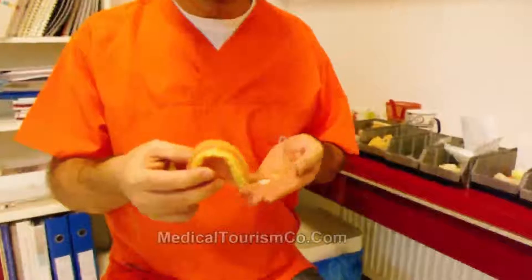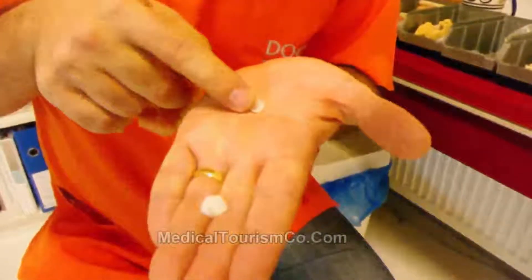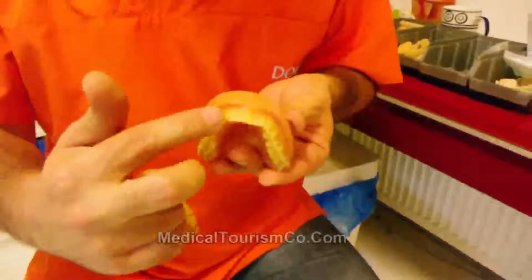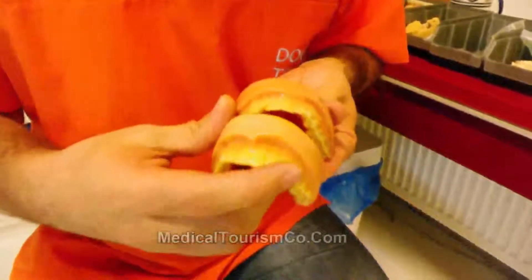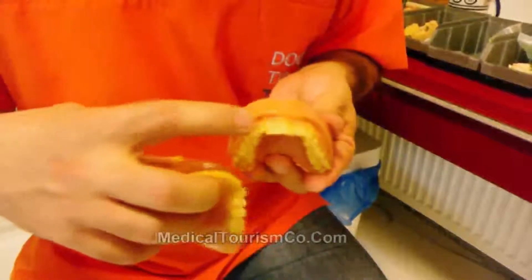Also laminate veneers. Laminate veneers are thin veneer materials made of porcelain. Different kinds of ceramic porcelains are used for this purpose. They are very thin surfaces and we bond them on the surface of a prepared tooth, so we can correct teeth that are in malposition or not in correct and straight alignment, by placement of the laminates on the anterior part of the teeth.